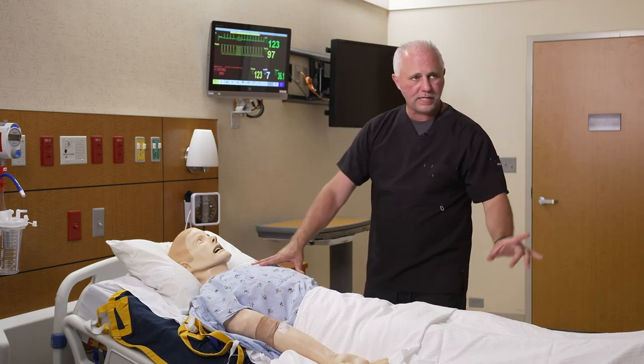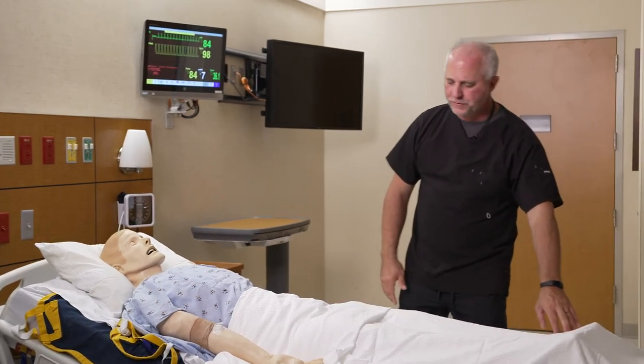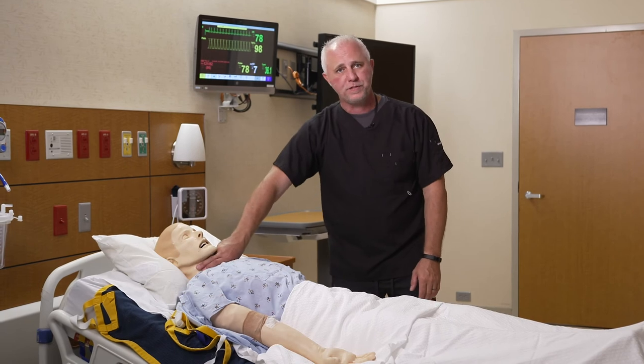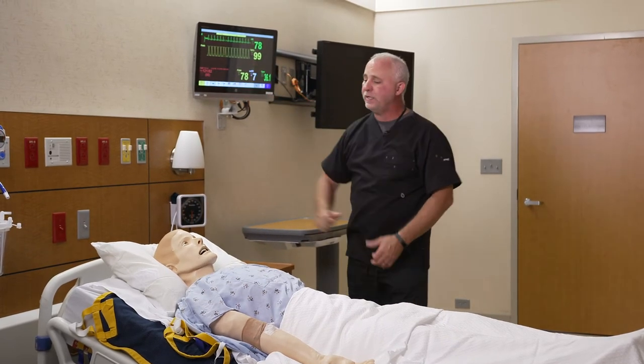Everything on him is anatomically correct. He has a pulse everywhere you have a pulse — he has a pedal pulse in his foot, radial pulses on his hands, and carotid pulses here. They are all represented by the numbers on the screen as well.